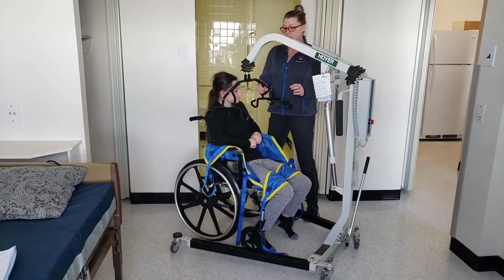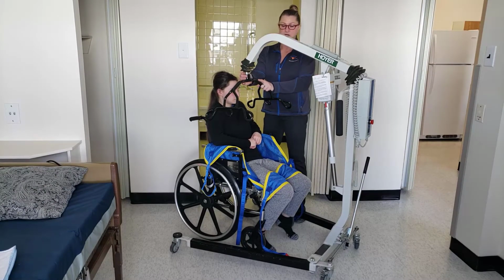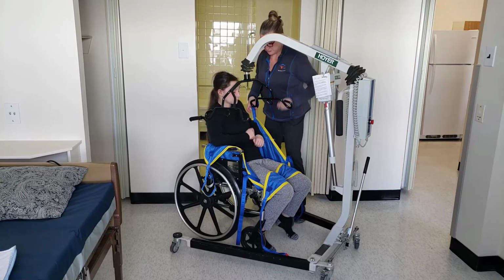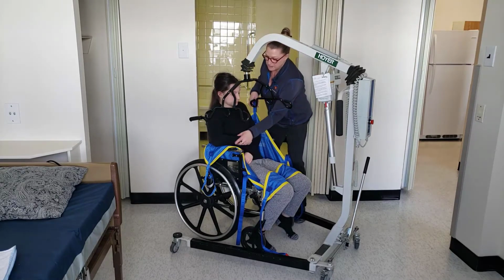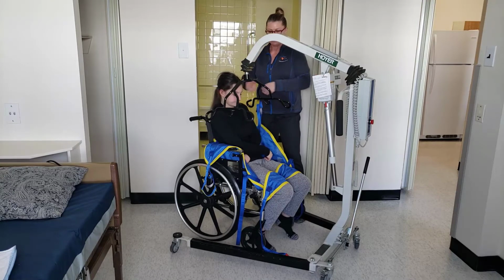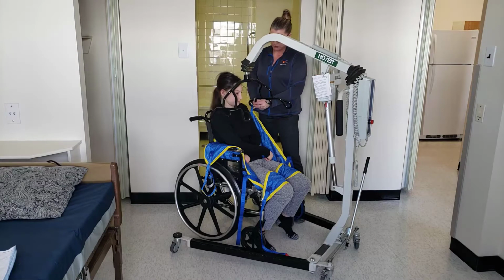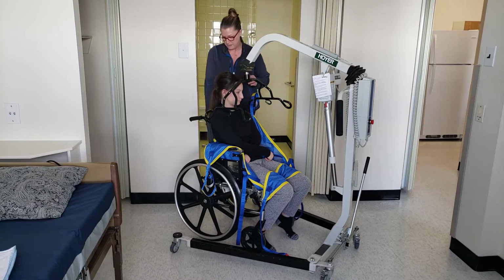So when you're hooking up the Hoyer lift, you're going to bring the Hoyer lift in towards the tenant, making sure that the swivel bar does not hit their head. Again, you're going to start with the shoulders. So you want to make sure their arms are inside. You can do it crossed over, however they would like them to be. So you're going to put the shortest strap on the top.